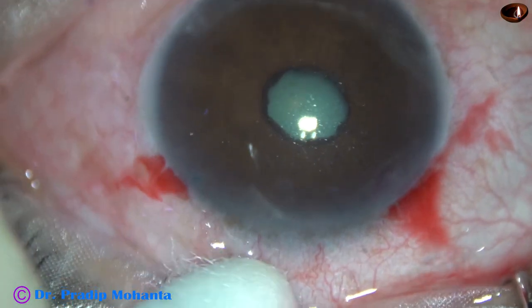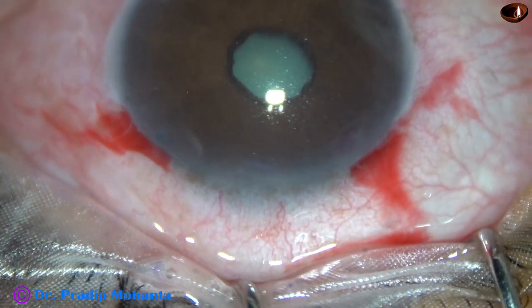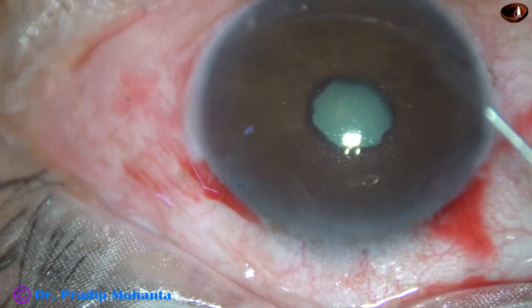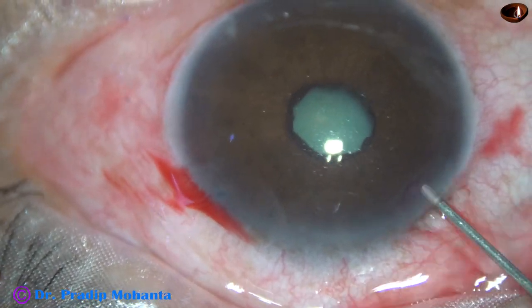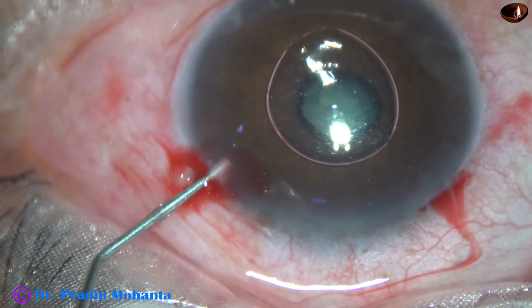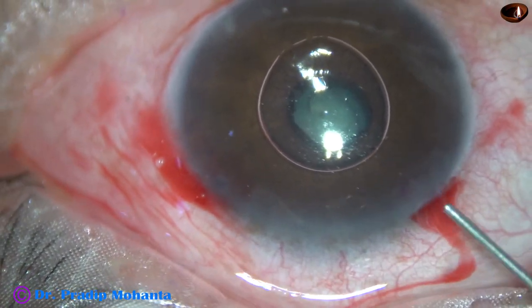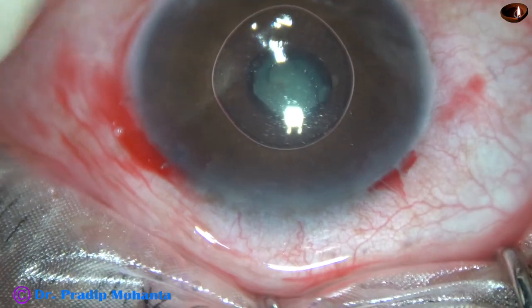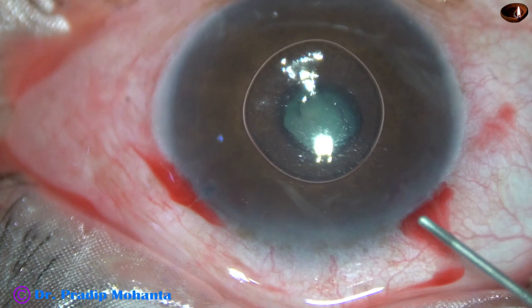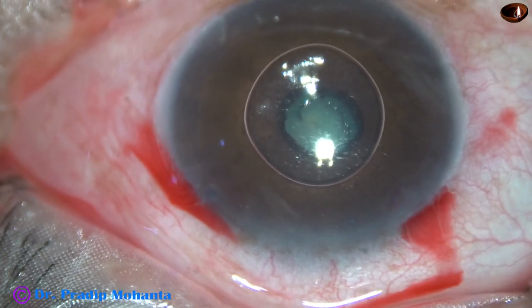The case is under peribulbar anesthesia and there is some vitreous upthrust. So the intraocular pressure is on the higher side, and as I inject air, the air is not staying. There is some vitreous upthrust in this case — some positive vitreous pressure.